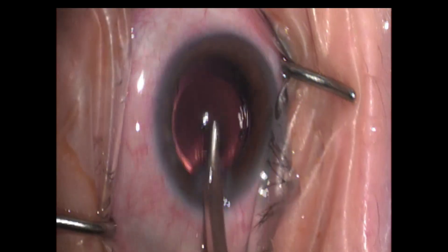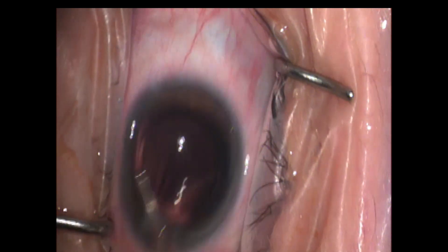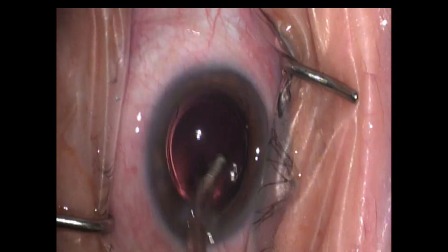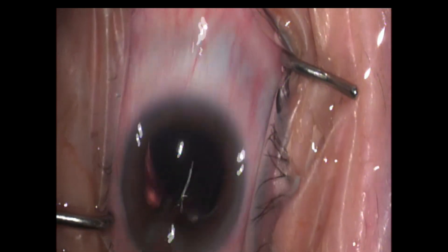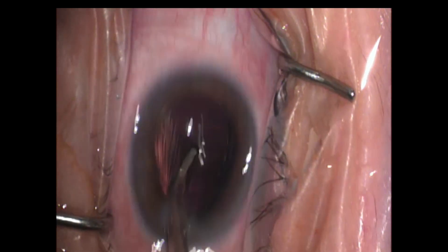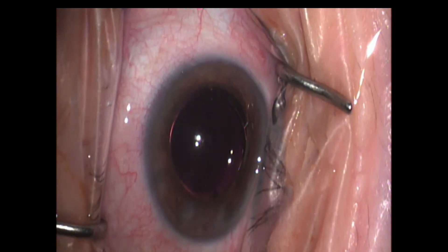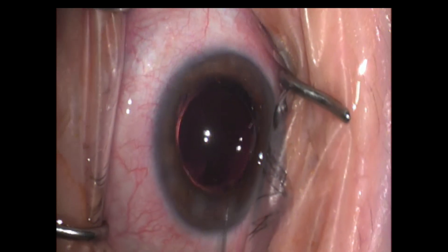That lens is now in. We're going to remove the rest of our viscoelastic. I like to take a little bit of time and make sure we got all of it, so we can avoid those post-operative day one IOP spikes. Here you can see us cleaning out the eye quite nicely. I like to lift up the lens and try to remove all the viscoelastic from behind the lens, especially with these lenses where they have those four little turtle legs sticking up — it's easy to trap viscoelastic behind the lens.